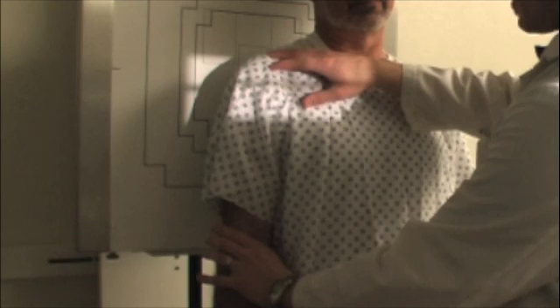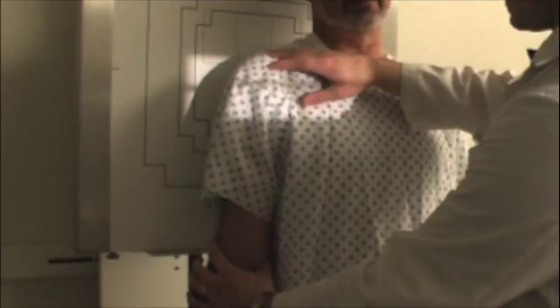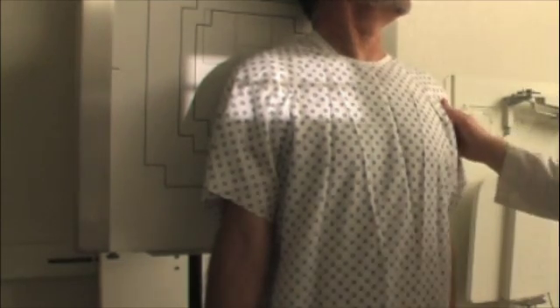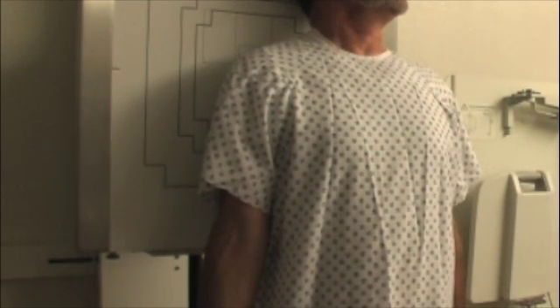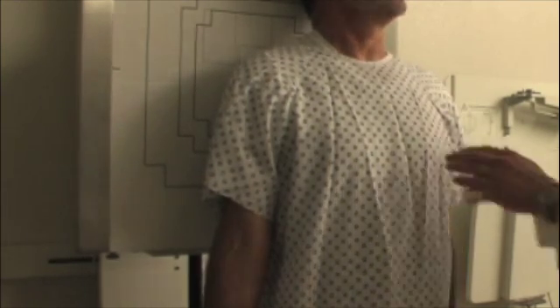So for this first one, I'm going to rotate your arm out just a little bit. There you go, just like that. That's great. I want you to look out towards me this way. Great. I want you to take a breath in now. Hold your breath. You can breathe. I'm going to keep it just like that, just for another picture here.